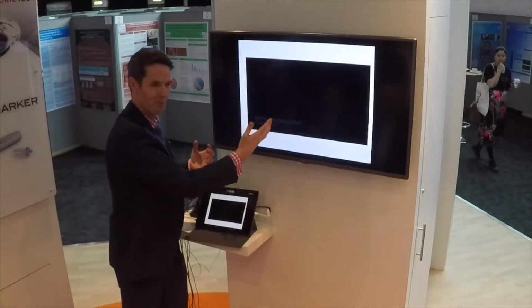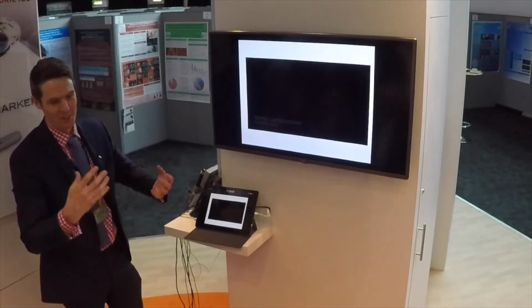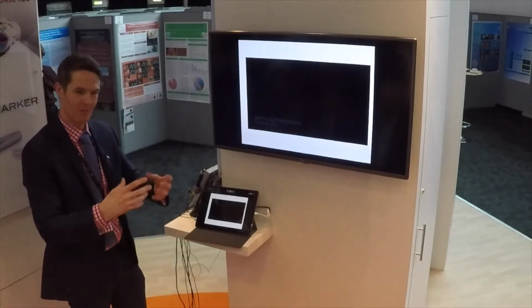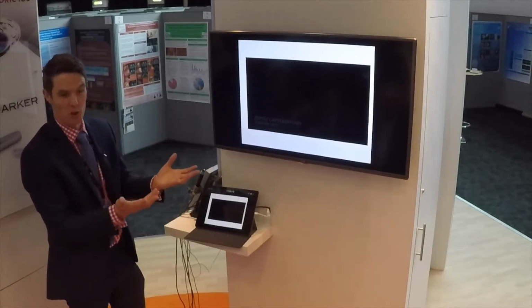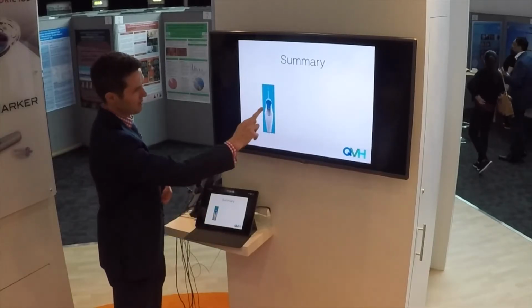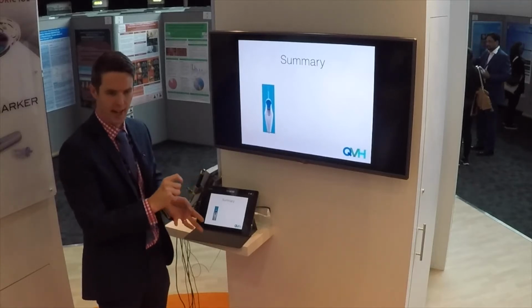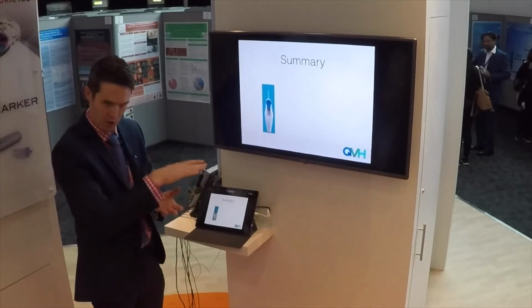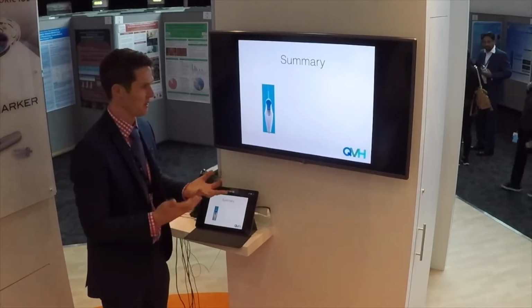But basically what happens, you'll have to accept my explanation, is that I recognise that you just turn off the vacuum, put the viscoelastic in, recenter the thing, and it's all fine. So it's controllable because it's under direct vision. So that's the handpiece, easy to use. After about your first 10, it's very comfortable in the hand and you get used to the movements and the entry and the exit. But it's not a big learning curve, it's pretty simple.